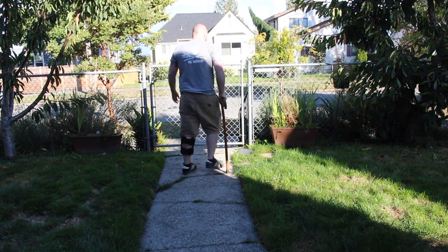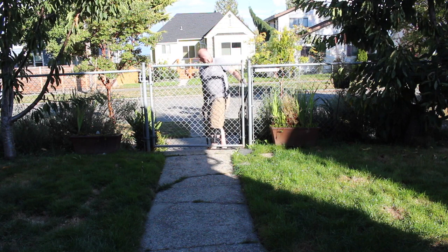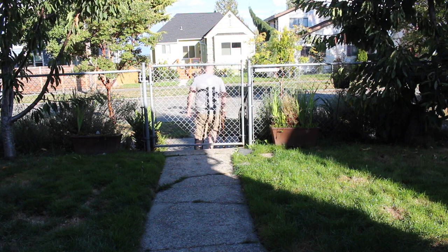An afternoon project done — off to see the world. Hopefully I won't have to use the cane for a long while, but if I do, at least it fits now.